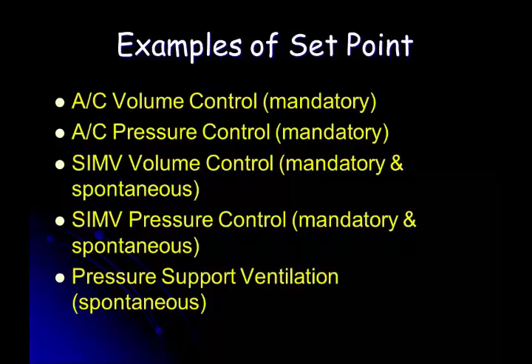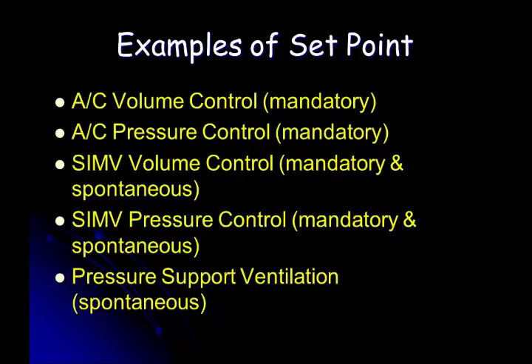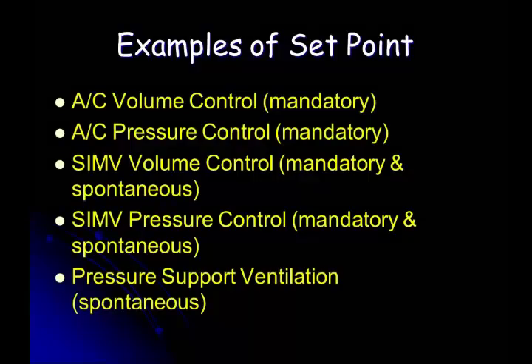Does the system reset after a spontaneous breath? Oh, yes. The systems are quite sophisticated in that if you were to stand there with a stopwatch, it wouldn't be exactly 6 seconds, because it has a little window where it says, if you start a breath at 5.8 seconds, I'll go ahead and give you the mandatory breath now. Those mandatory breaths can be volume-oriented or pressure-oriented, same as in assist control.